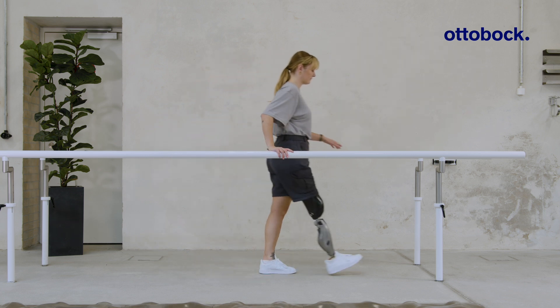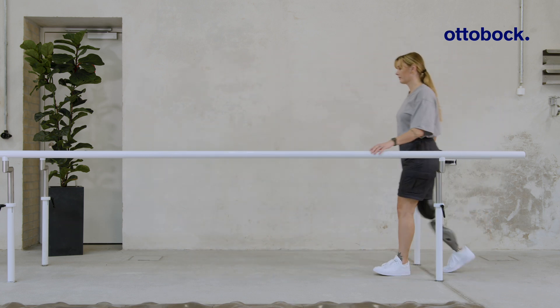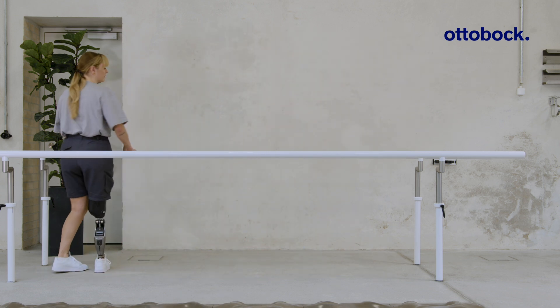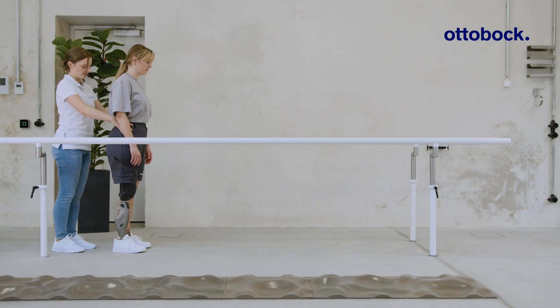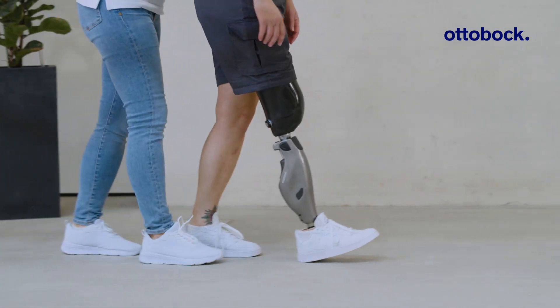During gait training, it can be difficult to determine whether a user has achieved stance release. With the stance release feedback function, the knee joint gives acoustic feedback whenever stance release occurs. If the feedback is absent, this means that not all criteria for stance release have been met.